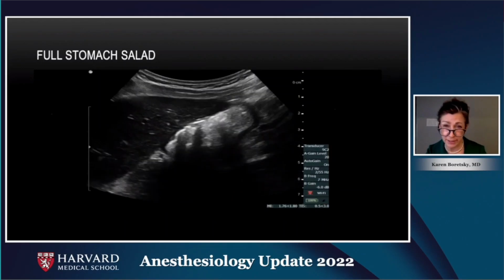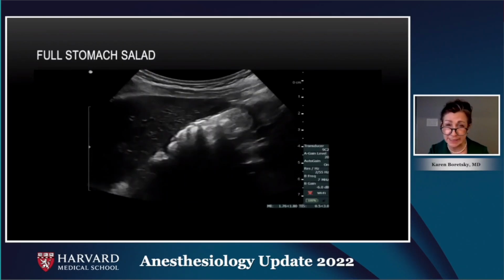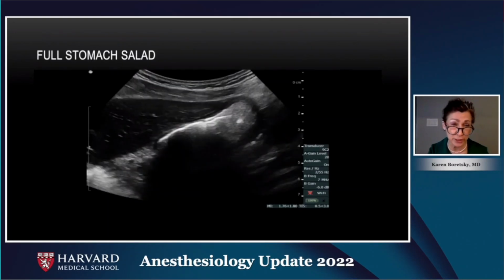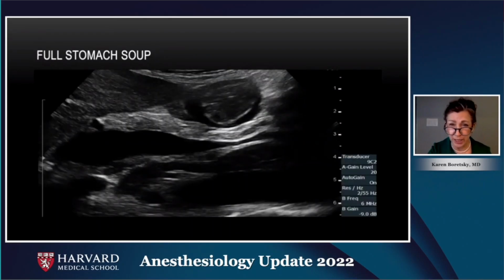This was not a kid who was NPO. This was one of my research assistants. She had just eaten a salad, and I wanted to show the difference between her stomach and the one with the soup. Let's go back to the soup.